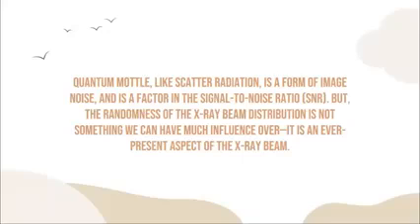Okay? Quantum mottle, like scatter radiation, is a form of image noise and is a factor in the signal to noise ratio. But the randomness of the X-ray beam distribution is not something we can have much influence over. It is an ever-present aspect of the X-ray beam. Maski unsa pa imong buhaton ana, maski unsa pa kagwapo imong image, naa gihapon siya mottle. But ang gwapo lang ana is pag gwapo ang imong image, less apparent ang inyong quantum mottle.